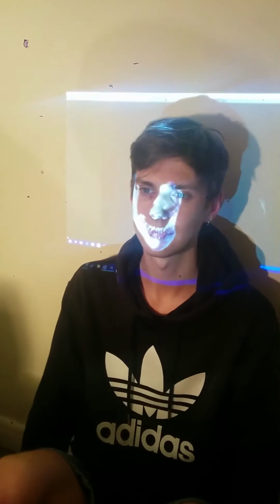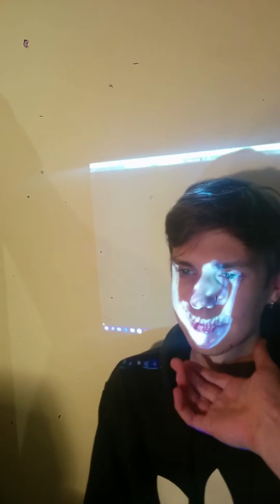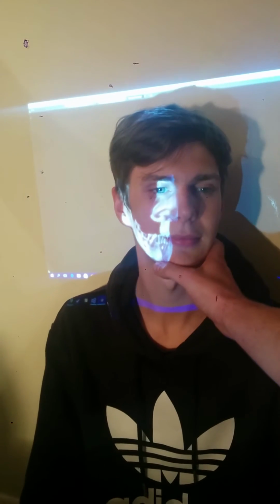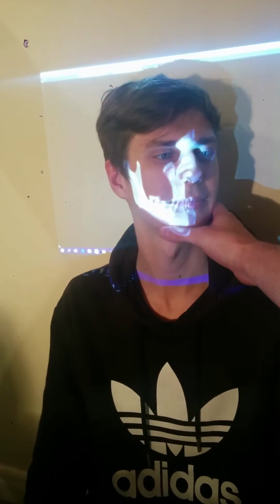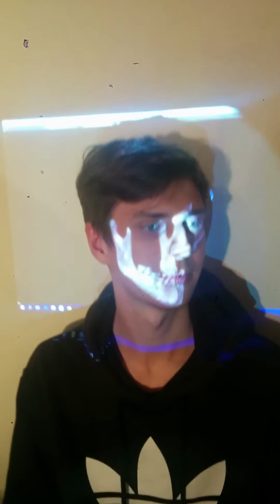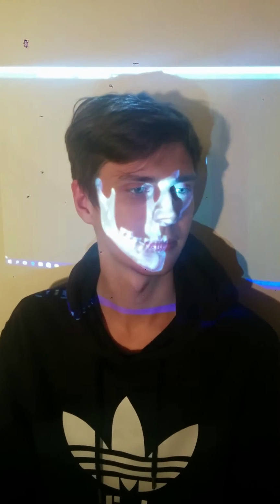And if the patient is now realigned, oh sorry, I meant as in realign the image on the patient. As in, you turn your head to the left, and then, because the image, sorry, this is just where the image is being located. And you can now see that the STL file has now been aligned with the patient's face, and it's been performing very well.